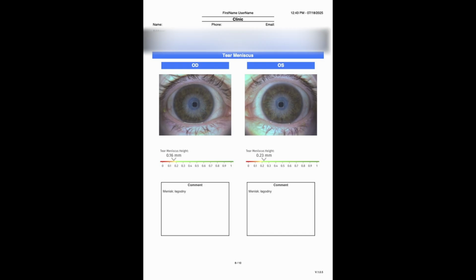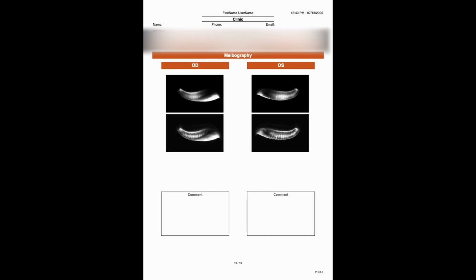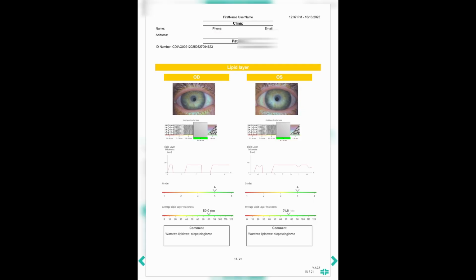Or this machine is meant for premium practices, where you have a staff that's going to ask the questions and the patient doesn't have to do anything. So this is also maybe the philosophy behind this machine, because this is a high-end dry eye diagnostic platform. Another thing that I find quite problematic with this machine is that it's pretty pricey. That's a problem. And then you see things like the knobs, right? I thought that when you pay so much, you will have an electronic chin rest. Here it's still manual, so I think it's not really that good.